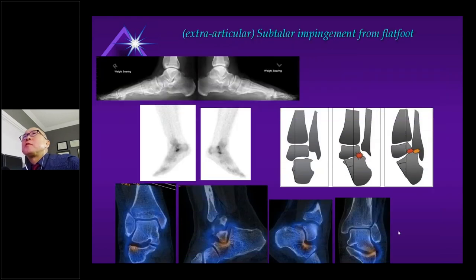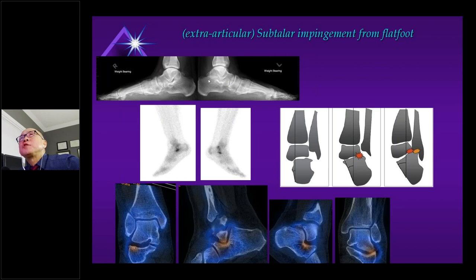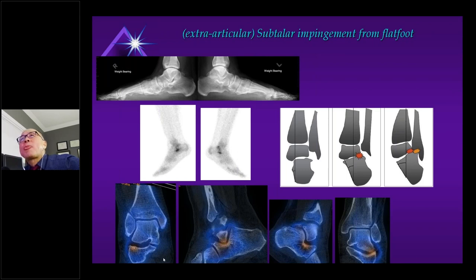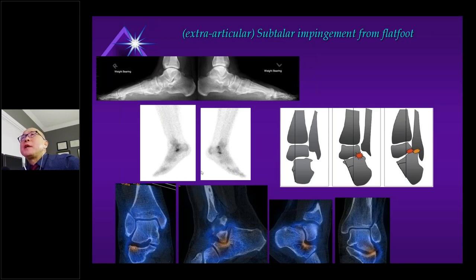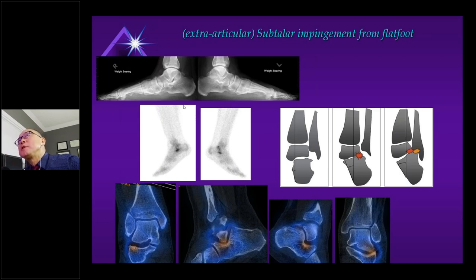People with flat foot get subtalar impingement — some authors emphasize 'extra-articular' to distinguish it from arthropathy. Abnormal axial loading from flat foot shifts weight bearing anteriorly, and with a lateral predominance you can get sub-fibular impingement. SPECT-CT beautifully demonstrates the typical pattern of subtalar impingement. These radiographs were only obtained after SPECT-CT — the patient was not even documented to have flat foot, as no weight-bearing views had been obtained. SPECT-CT was highly suggestive, and when I requested follow-up weight-bearing views, flat foot was confirmed as the cause of chronic hindfoot discomfort and impingement.